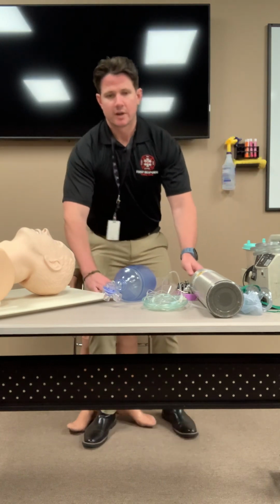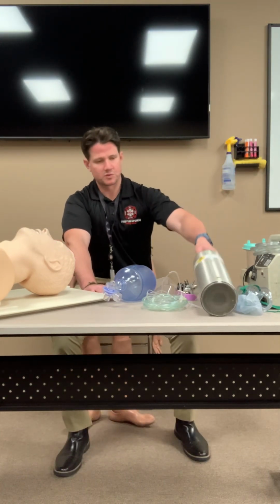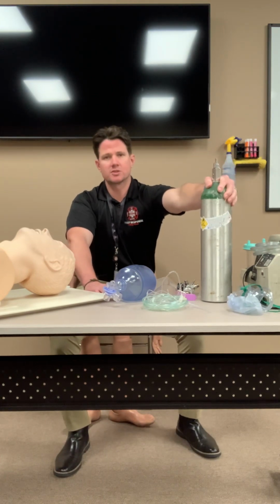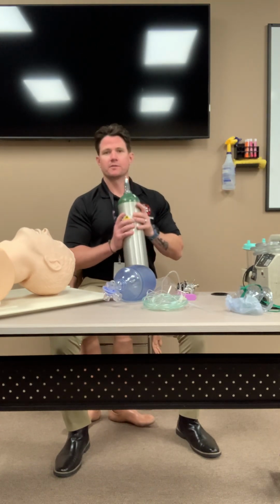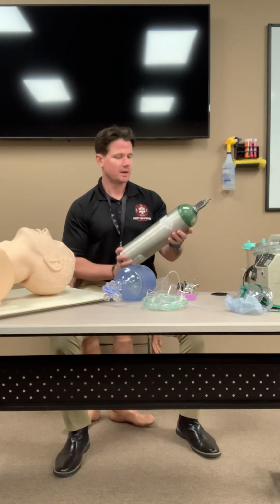We start out oxygen administration by setting up our oxygen tank. The first thing we want to do is grab our full oxygen tank, and we want to inspect it. I'm inspecting the tank itself for any cracks, dings, structural damage, ensuring that there's none of that.